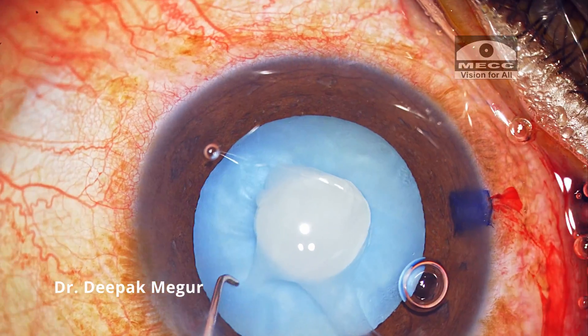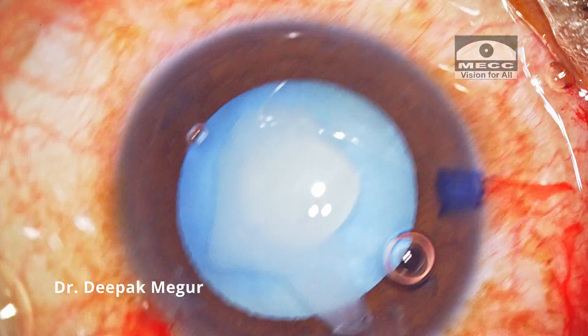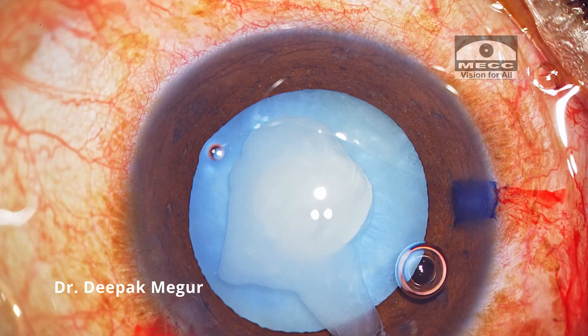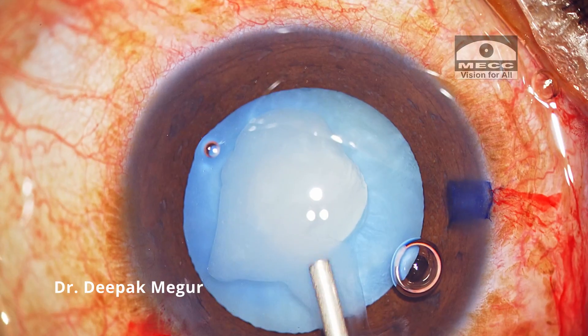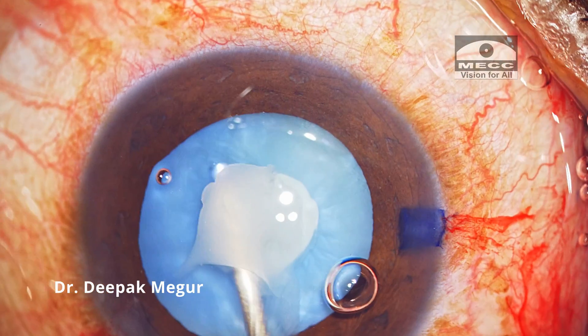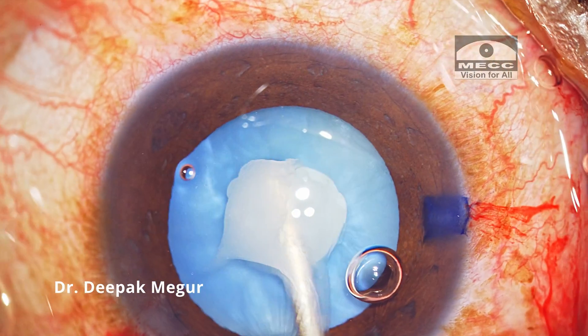I was quite successful in getting a small rhexis and now is the time to decompress. Since the swollen cortex is jelly-like, I'm using a thick-bore 23G cannula to manually aspirate the cortex. I've connected this cannula to a 5 ml syringe and I'll be aspirating manually.